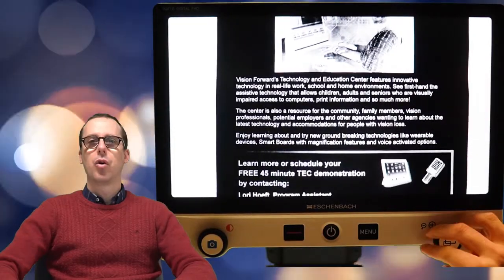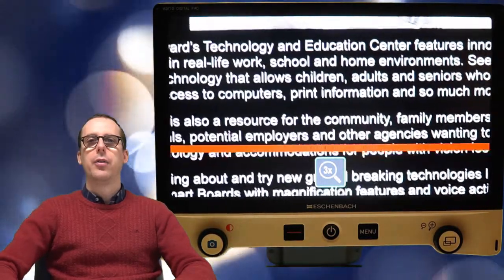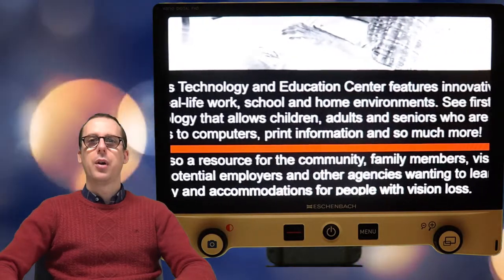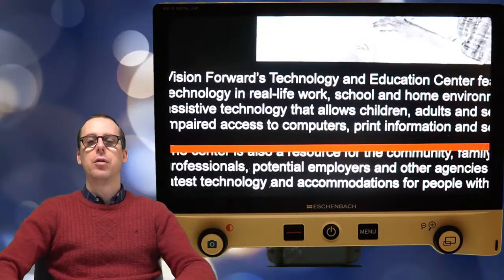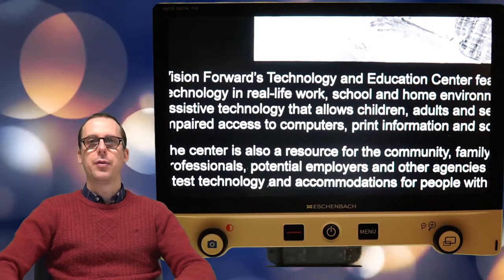Now, the line marker button is going to be, amazingly, to turn on and off your line markers. And you can have those oriented vertically or horizontally. And that's a nice little feature. I don't know that many people use them, but it is nice to have them there. If you are using high levels of magnification, they can help you keep track of where you are as you read. So it is a nice feature there.